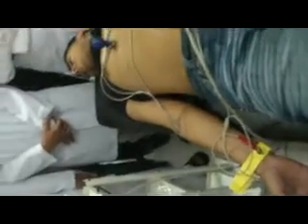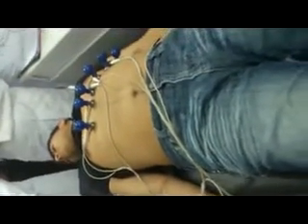See this? What is the speed? You can see the speed written here: 25 and 10. You can see also. This button can change the speed. Can be 50 or 12.5, 25. Never touch this, but just check. 25 and 10, that's all. Okay, you forget.